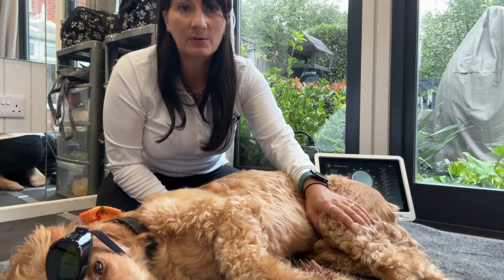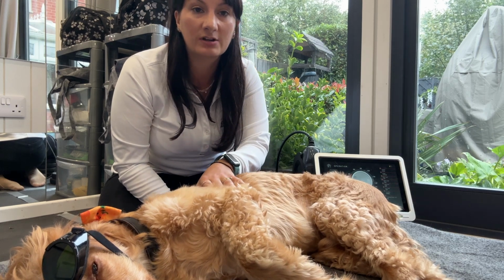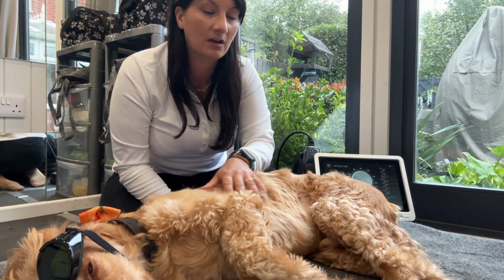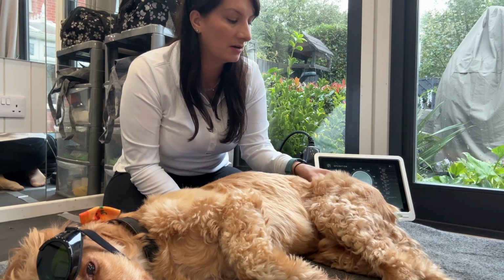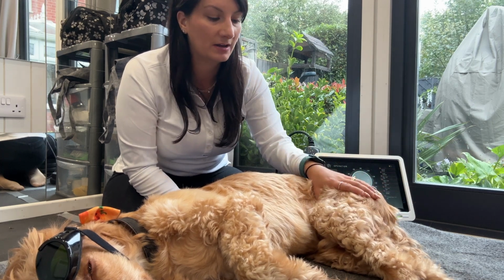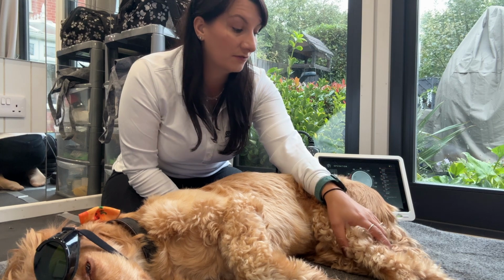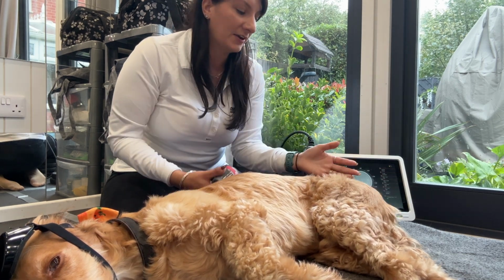There are times where point to point can be helpful if you're trying to do trigger points, if maybe you're not trying to cover a whole area. Again, there's various reasons, but if we're looking at larger areas, wanting to cover a larger amount of tissue, then scanning is the most efficient way, in my opinion, to do that.